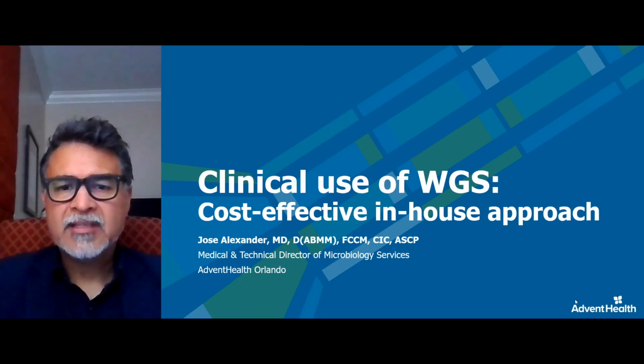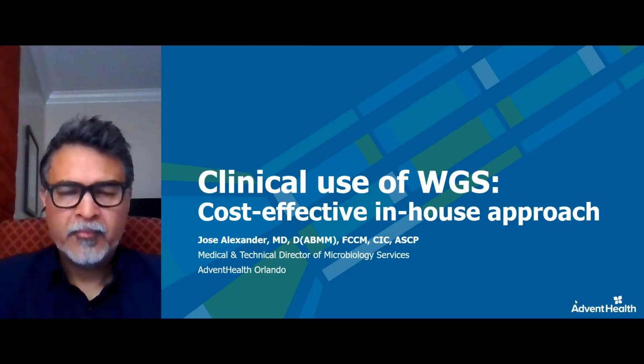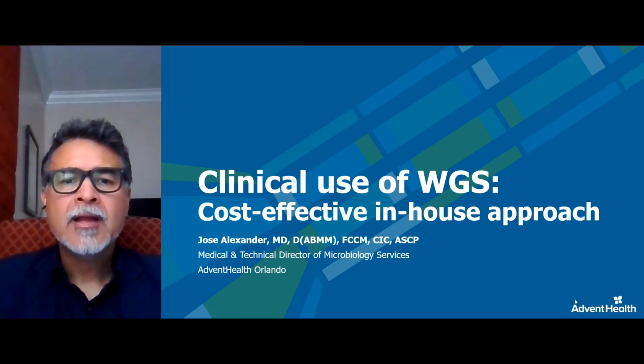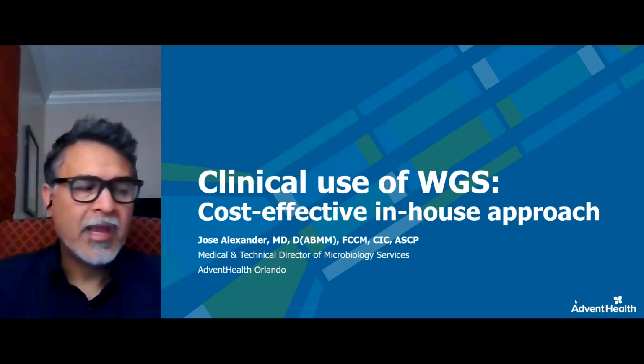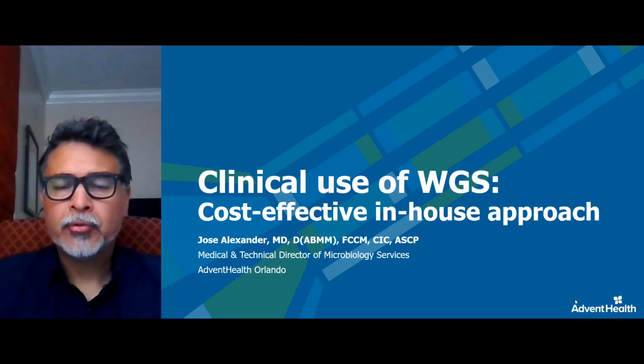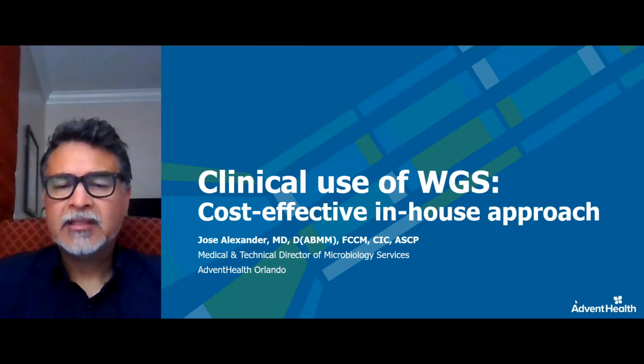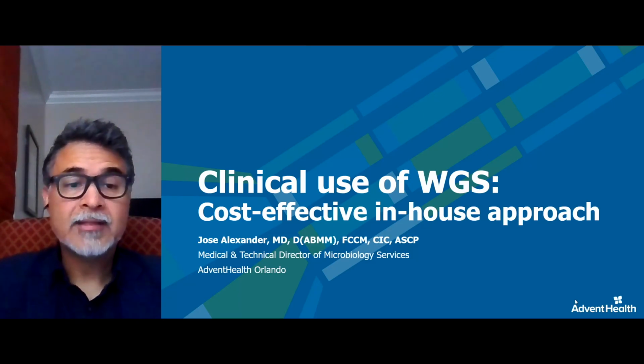I want to emphasize that the application we were able to develop was research use only for the MinION, the Flongle, and also the GridION, for our internal application as a clinical laboratory and a CAP accredited laboratory in the United States. This is the clinical use of whole genome sequencing as a cost-effective in-house approach for bacteria and fungi identification.